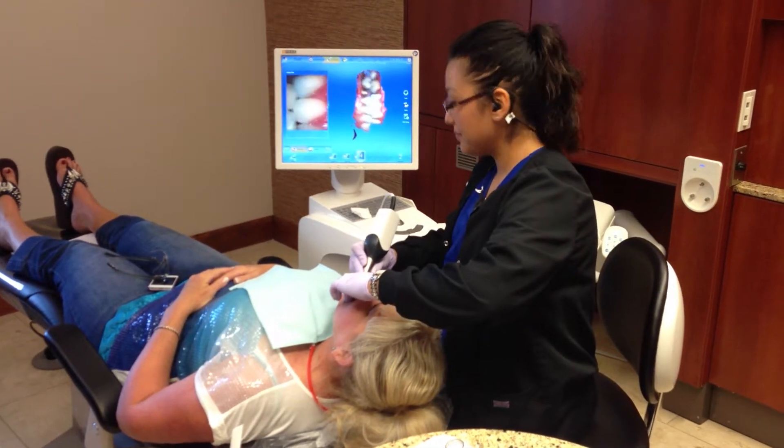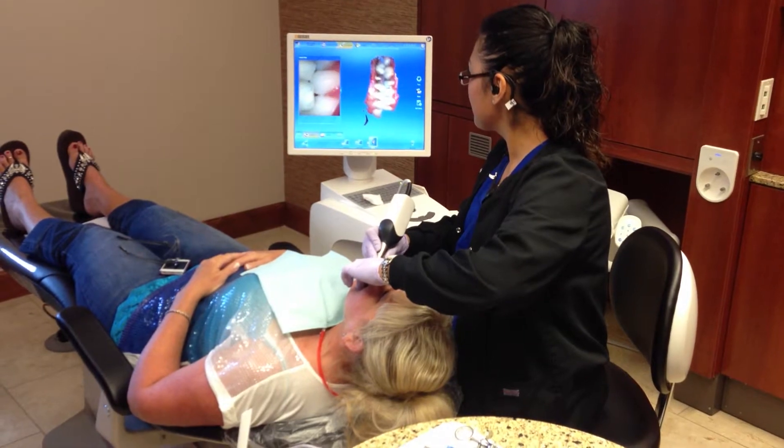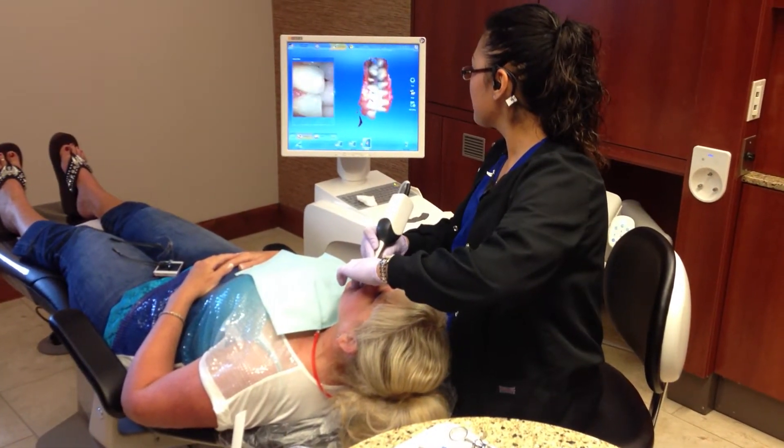Hi, we're here at Wichita Family Dental, and Patricia is using the new instrument that we're utilizing now. Patricia, can you tell us a little bit about what you're doing?